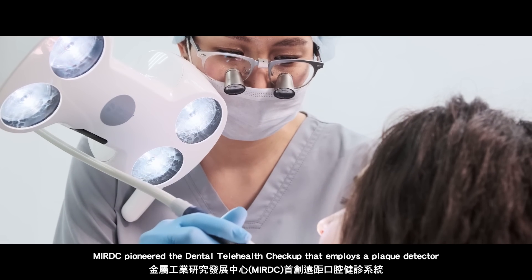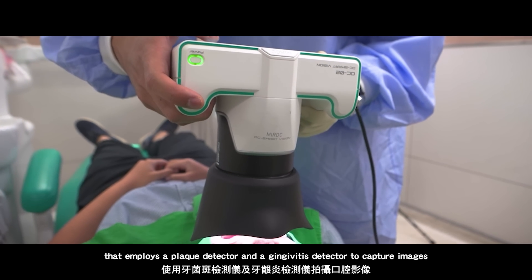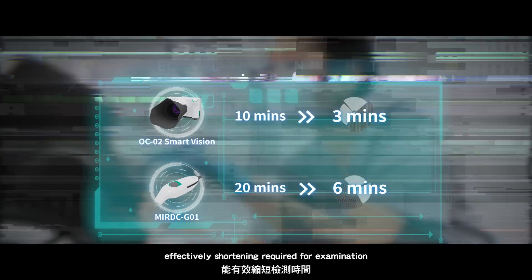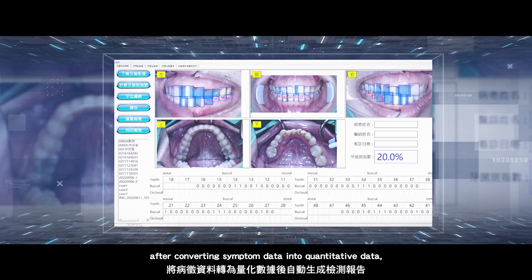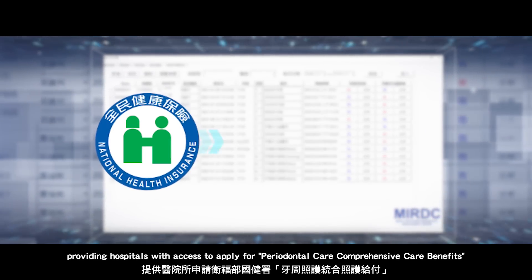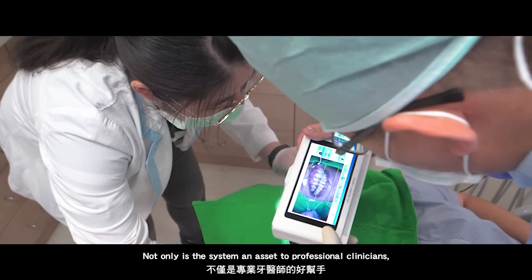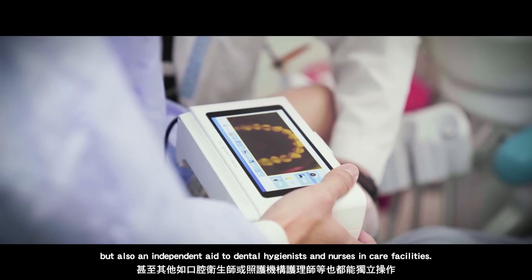MIRDC pioneered the dental telehealth checkup that employs a plaque detector and a gingivitis detector to capture images of the oral cavity and integrate them with the intelligent interpretation of symptom spectrum, effectively shortening the time required for examination and automatically generating examination reports after converting system data into quantitative data, providing hospitals with access to apply for periodontal care comprehensive care benefits from the Health Promotion Administration of the Ministry of Health and Welfare. Not only is the system an asset to professional clinicians, but also an independent aid to dental hygienists and nurses in care facilities.